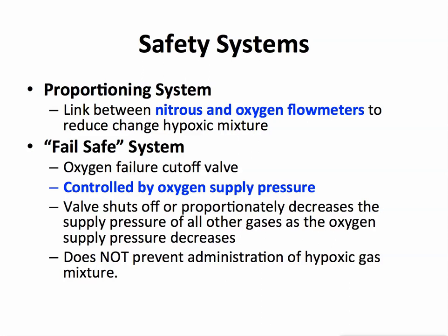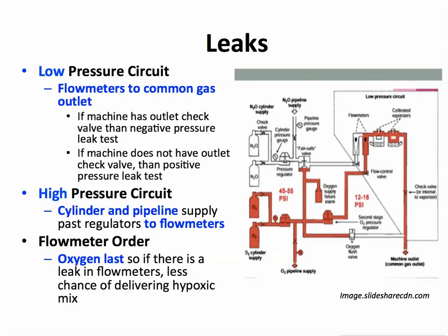So it's a pressure that is controlling the system. So it's not really fail-safe. Let's look at leaks next, and then scavenging, and then we'll be done.